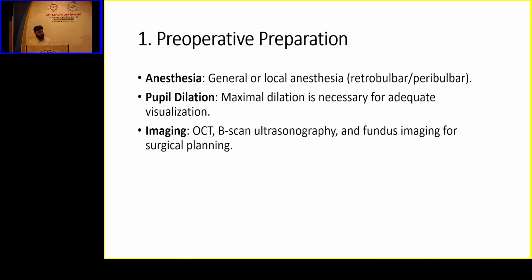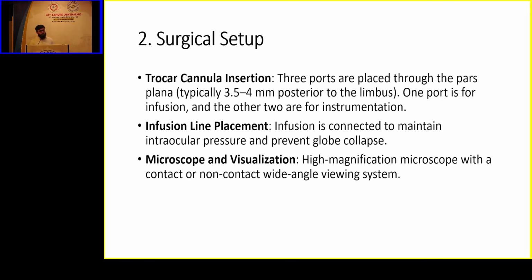So firstly, we have to do the pre-operative preparation like in any operation. A good anesthesia is also very important, adequate pupillary dilatation for visualization, and you can do the imaging like OCT, B-scan if the view is clear. So the next step is the surgical setup.